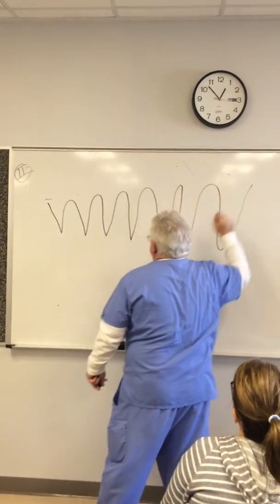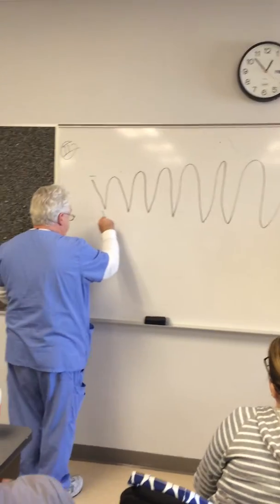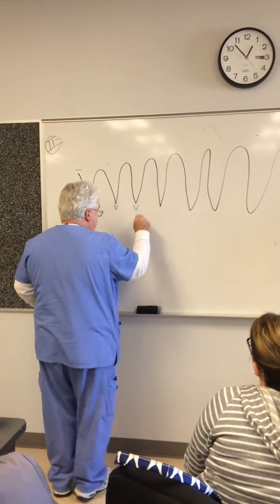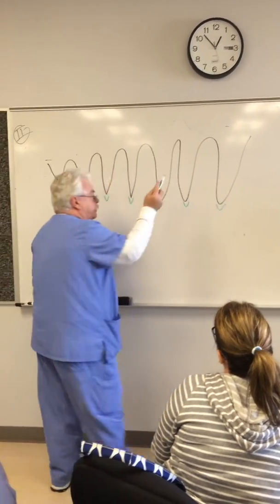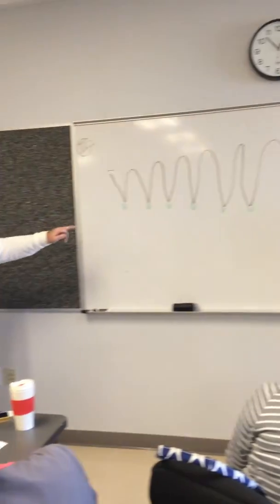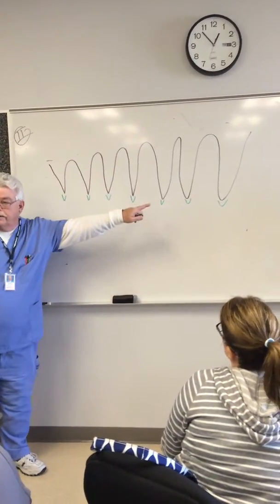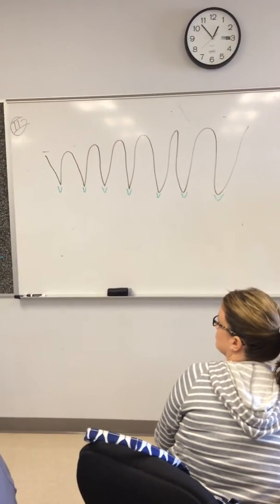What's this? Ventricle. Tap. VTAC. See how it's nice and even? Well, it's supposed to be, and it looks kind of the same all the way across the sheet, right? All the way across the strip. I put little V's in here, so you can see that it's VTAC. This is an easy one.